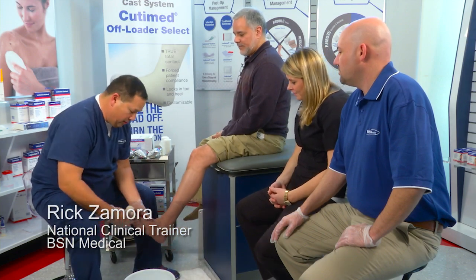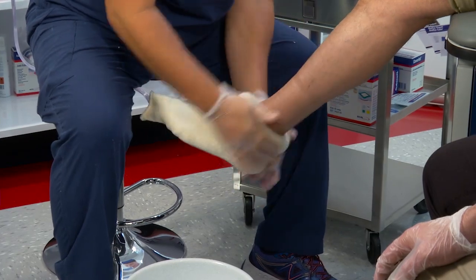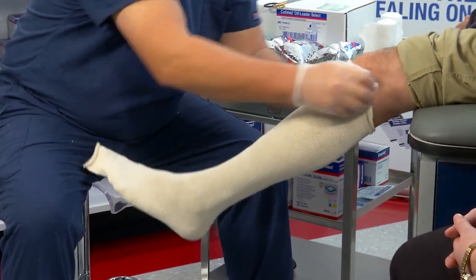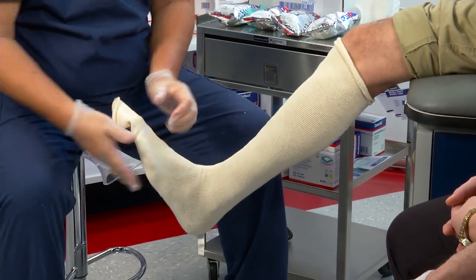We're going to apply this terry net stockinette to the foot. I want to roll this up in the leg, do a little bit of a tail right there, and you have to maintain the 90 degree angle for that to work.